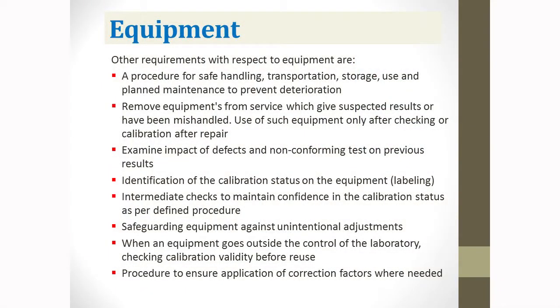You need a procedure for safe handling, transportation, storage, use, and planned maintenance of equipment to prevent deterioration. Equipment that is not functioning or needs service must be removed from use or clearly labeled. ISO 17025 is strict: label or mark it, ideally remove it from the laboratory. Calibration status must be identified and labeled on the equipment, and when equipment goes outside laboratory control and returns, calibration must be rechecked.